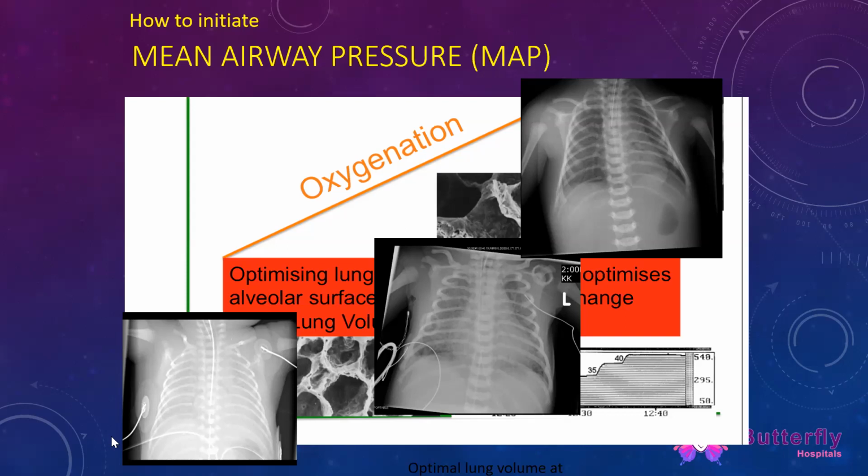So as clinicians, when you initiate high frequency ventilation, it is our responsibility to stand bedside and do more regular monitoring, both on the chest wiggle and the X-ray, that will help you adjust the mean airway pressure according to the baby's clinical condition and X-ray findings.